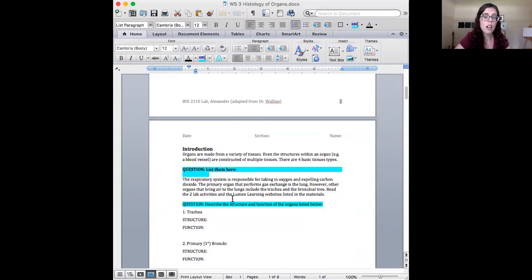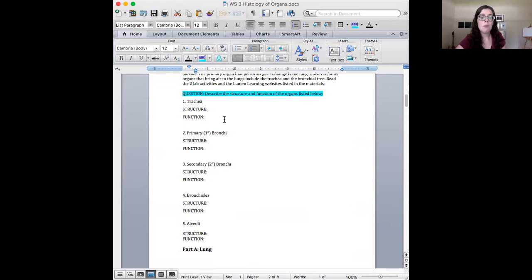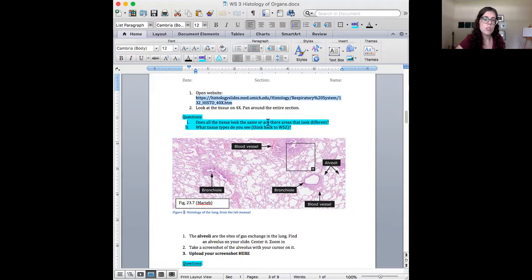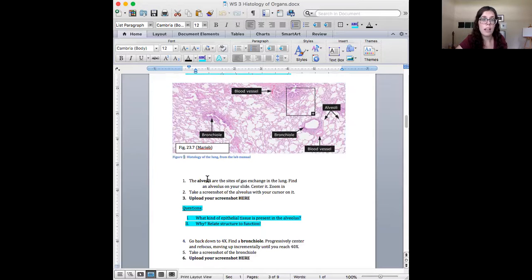Okay, so we start off, I want to make sure that you actually did the reading part. So talk about the 4 basic tissue types, give me some information about some organs in our respiratory system. And then we're going to do a similar activity to what we did last time. So you're going to go to this website, you're going to pan around the section, you're going to answer questions. What do you think about the tissue? Do you see any tissue types, right? You're then going to try to find an alveoli. I give you an example here, and you're going to upload a screenshot.